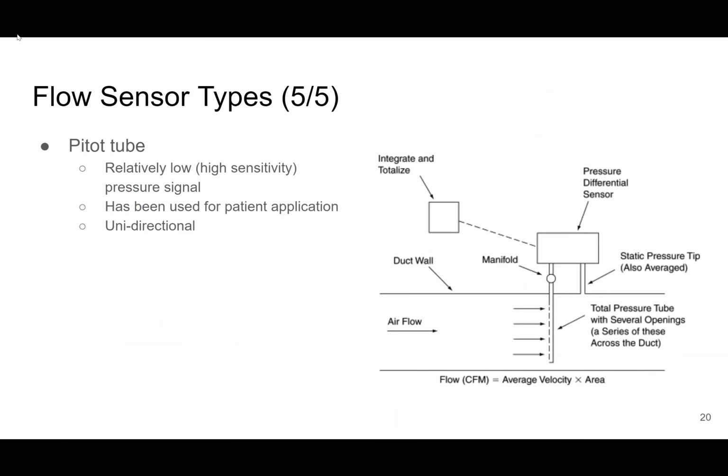The last one we haven't really looked at in this project, but we have used a fair bit before in our other engineering projects, is a pitot sensor and constrained flow. I haven't actually done a mathematical comparison of all of the different options here, but they tend to have pretty small signals in general for the flow rates we're talking about, and a more involved construction design, trying to get that measurement without wall effects and things like that in the flow.